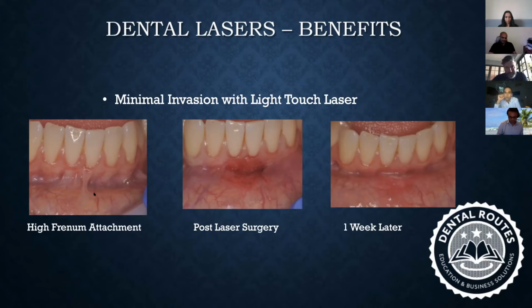I'll just take this example itself to make things clearer for you. If I've cut this piece with a scalpel, there is a trauma and then a normal inflammatory reaction. That normal inflammatory reaction causes a lot of swelling and pain to the patient. And now the whole cycle has to take a long path to calm down and then start healing. Whereas with laser, it breaks the path at every interval. When I'm doing the treatment, it is first cutting the messaging to the brain in terms of the pain pathway. It breaks the pain pathway. Because it breaks the pain pathway by a big way, the amount of inflammation that you see in the tissues is much lesser compared to traditional ways.